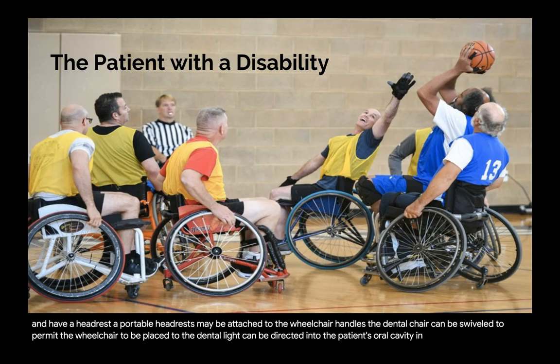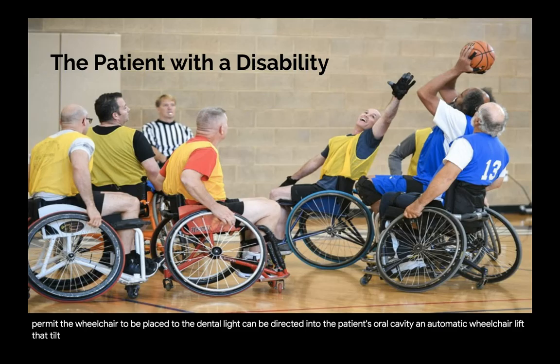An automatic wheelchair lift that tilts the chair back can be obtained for a clinic facility where patients in wheelchairs are frequently visited. Instructions for the caregivers.